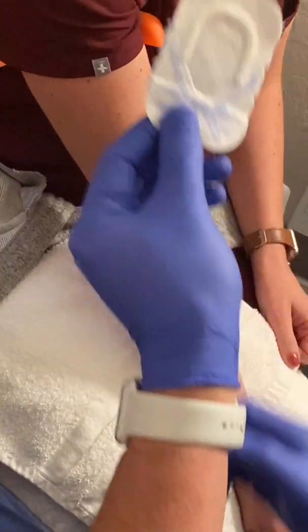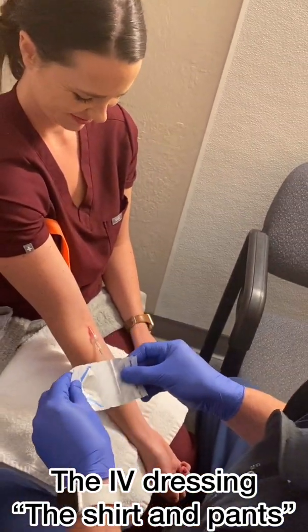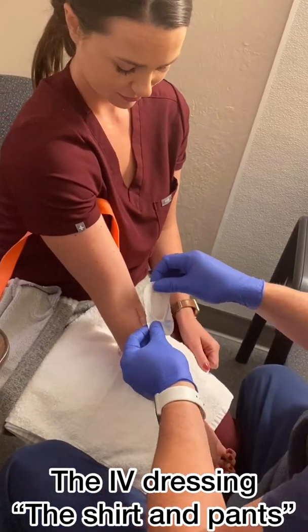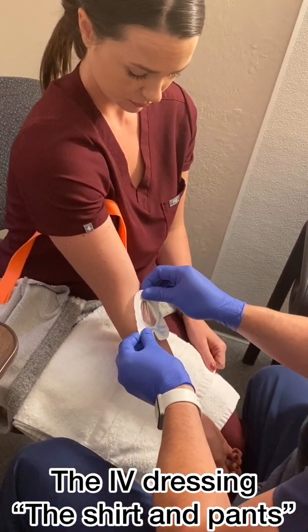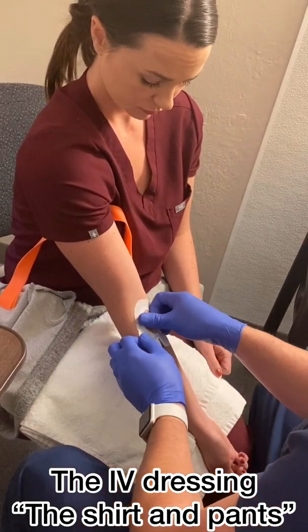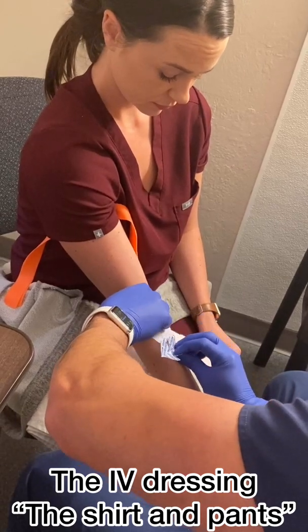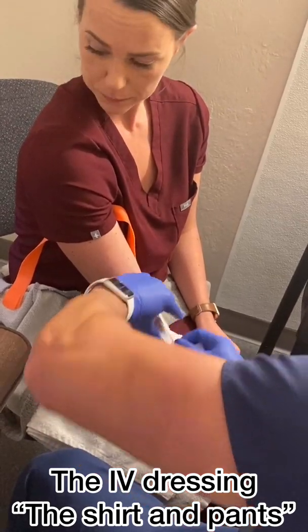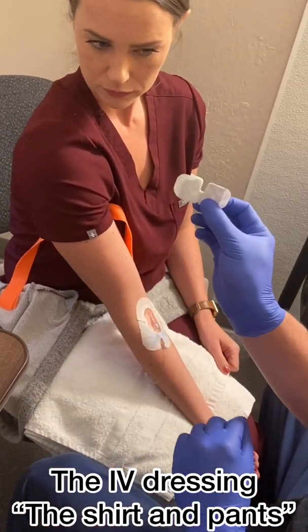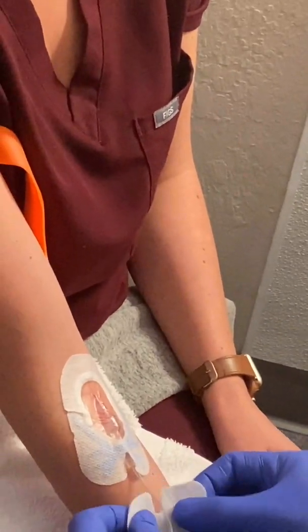At this point, we have a Tegaderm. We call this the shirt. This we place right over it, just like that. We call this the pants, because it goes right underneath, just like pants.